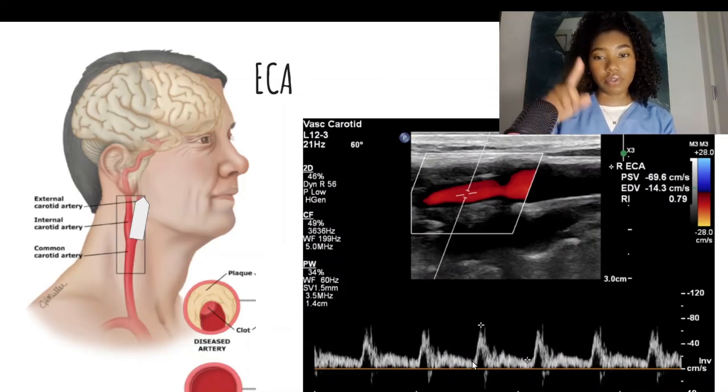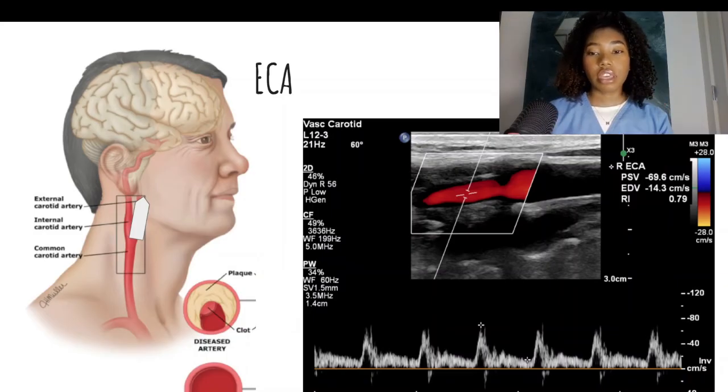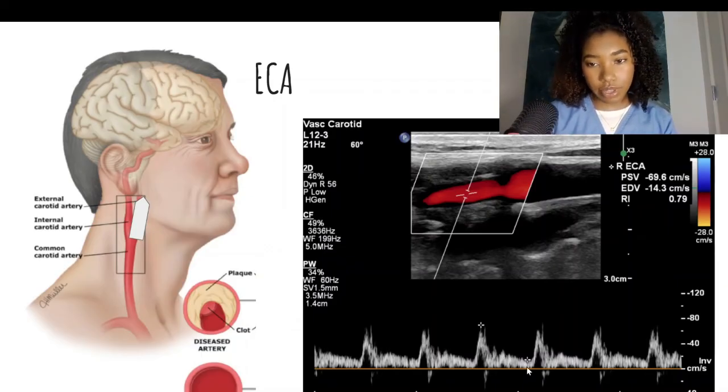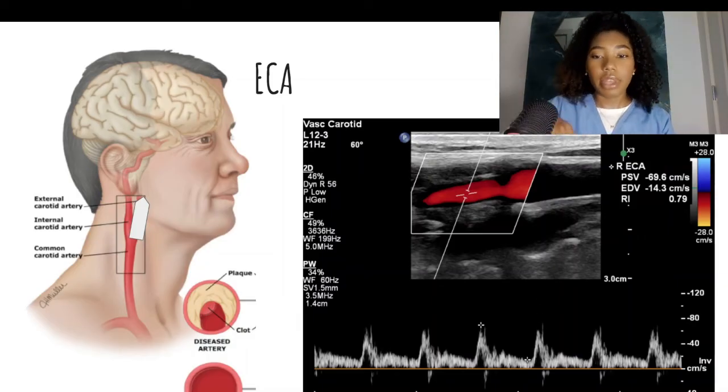You should have a high upstroke, and then it should come down for the end diastolic flow. Many times there will be no end diastolic flow, or it will be very, very low velocity. This is different from the ICA because the face does not need constant blood flow like the brain — it gives short bursts of flow at a time, then it trickles down.